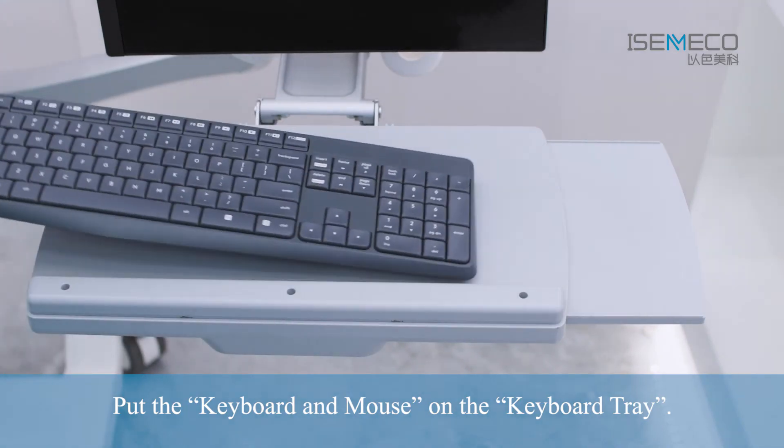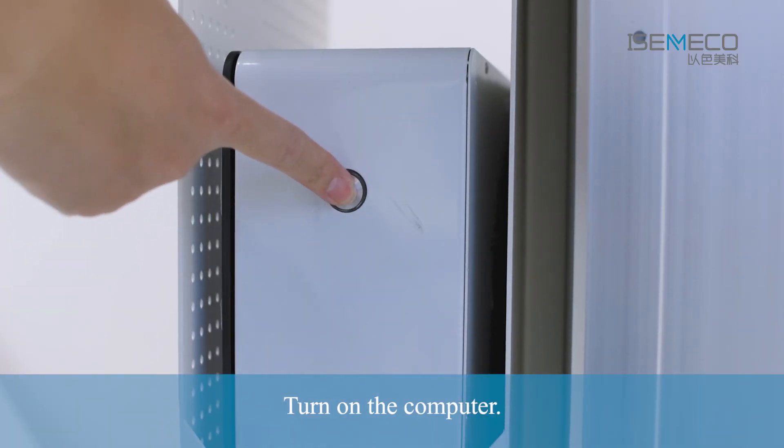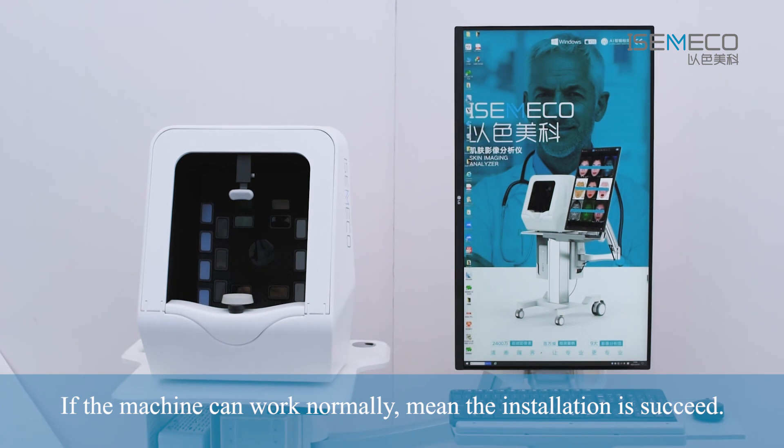Put the keyboard and mouse on the keyboard tray. Turn on the power and turn on the computer. If the machine works normally, the installation is successful.